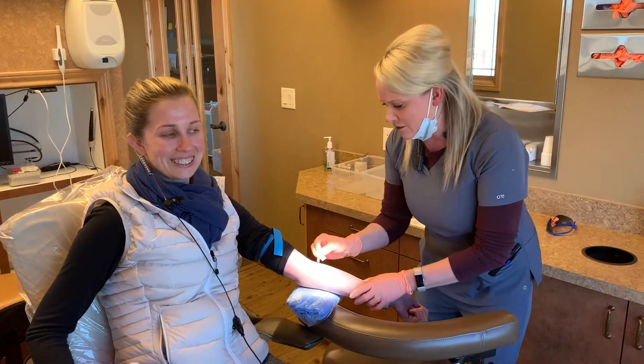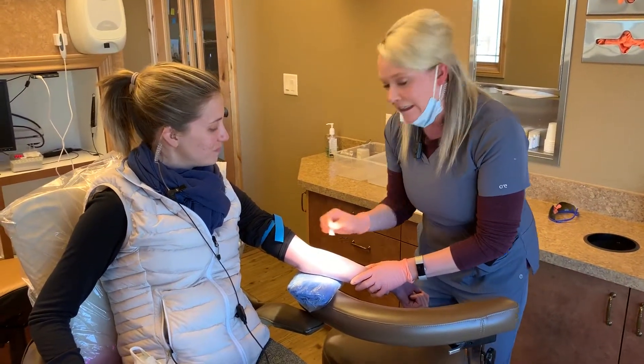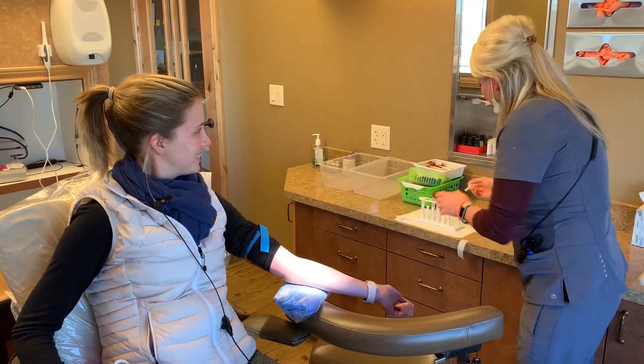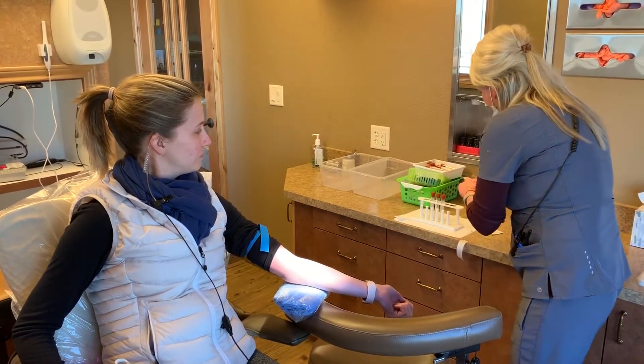So this is what we do here first. We just find a nice good vein, get it nice and clean. Give that just a chance to cool off there. I've already got my needle ready here.